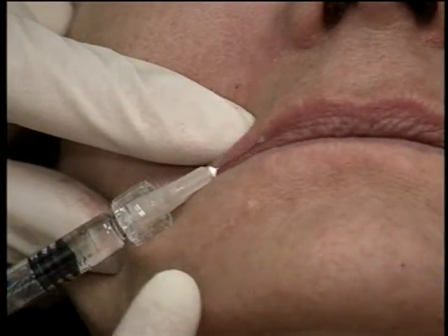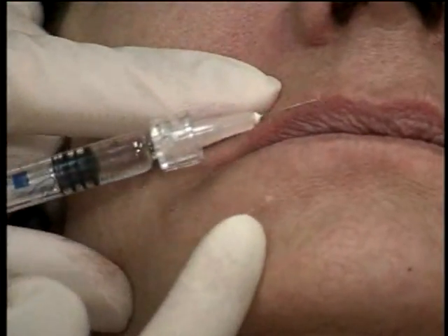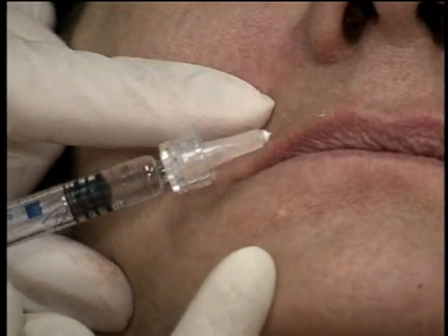Now, I have a couple tricks here, because if I want to rotate the lip up and show more red show, I may cheat a little bit onto the red portion of the lip. If I want to work on these fine lines here, I may cheat a little bit onto the white portion of the lip.